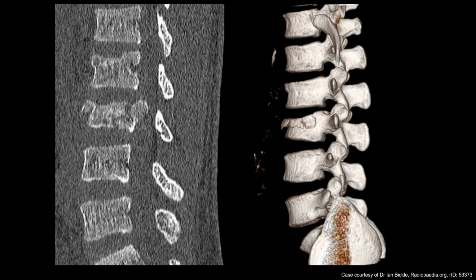Here's an example of a CT. So as you can see on the left, this is a cross-section, whereas if you had a normal lateral lumbar radiograph, you wouldn't see just the vertebral bodies as well as the spinous processes. You would see everything in front of and behind it. So here, with this plane, in the sagittal plane, you can see more detail of just exactly one slice. So if we notice here, this vertebral body is fractured, and you can get a better idea of fracture fragments and their location. Here is a 3D reconstruction taken from CT data, and again, it allows you to characterize what's going on with this fracture site.